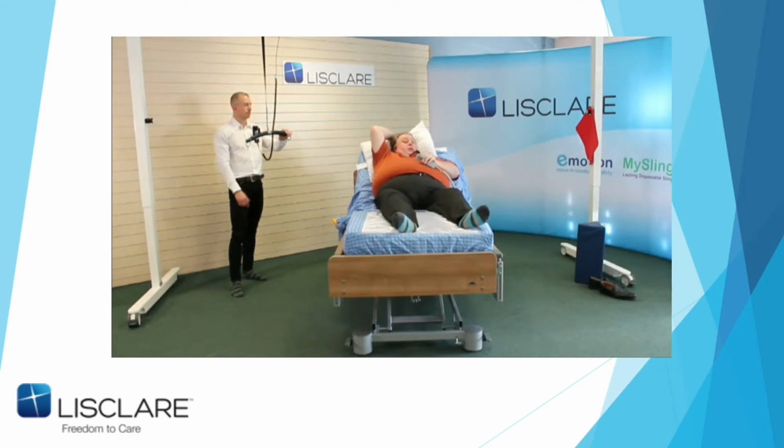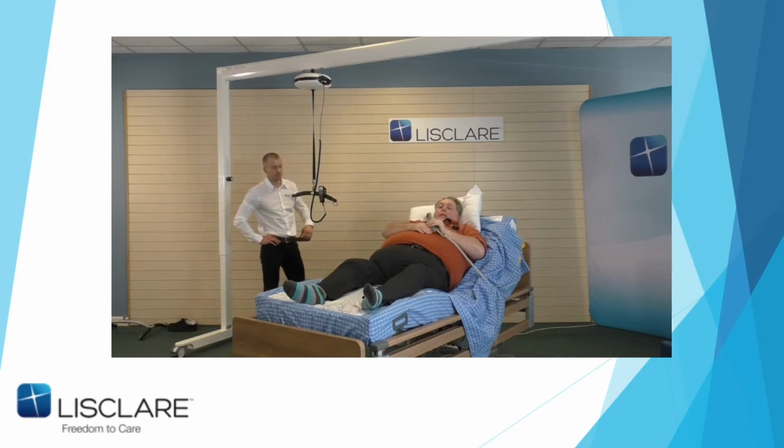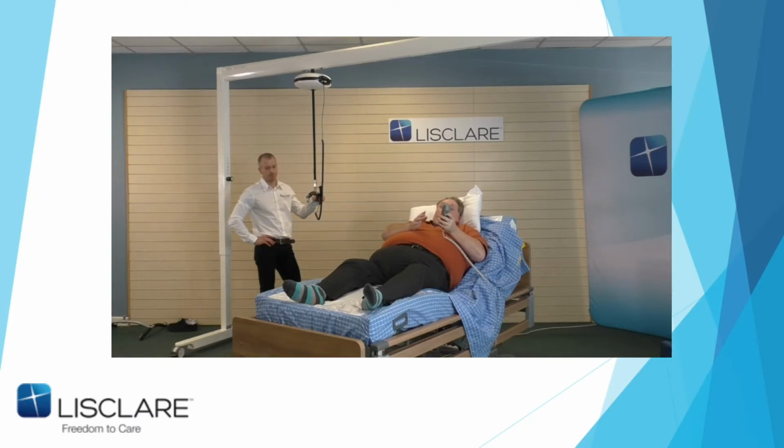There you go. You can actually see now my head's above the mattress, and I haven't slid down. Lucky enough with 2 camera angles, which we're trying for the first time to make sure it works, and it seems to be. So you get the idea. That's just 3 to 4 different ways of getting somebody back up the bed, as well as the classic where there's 2 carers where they're actually just treated like a slide sheet, and then they can lock it out.